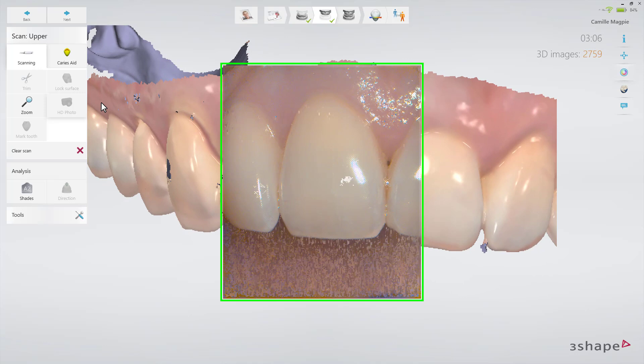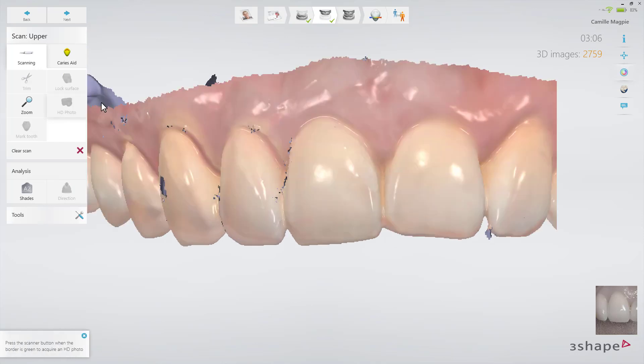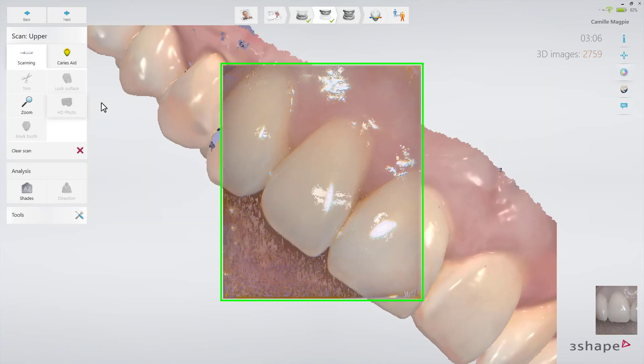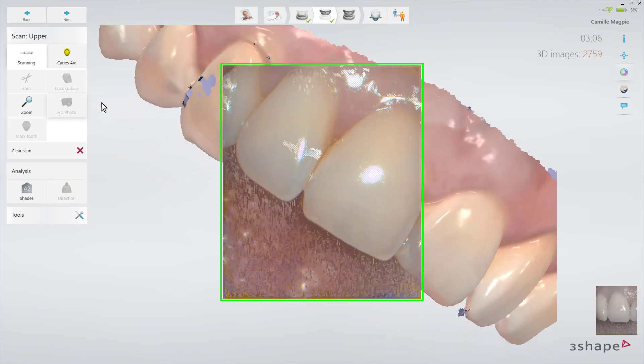When the frame of the scan box becomes green, press the Start Stop button on the scanner once to take a photo from this angle. This will add the HD Photo to the 3D model.